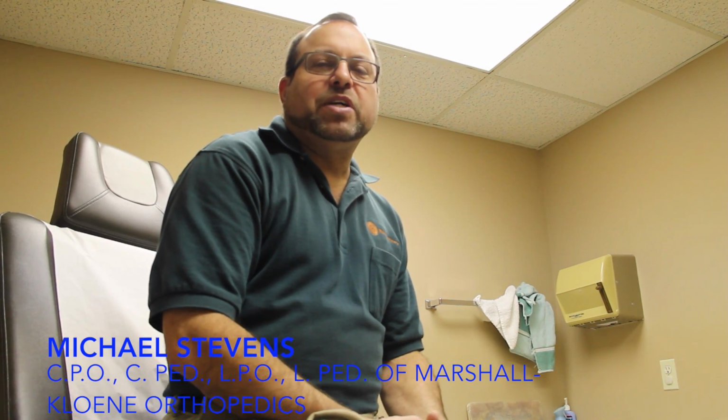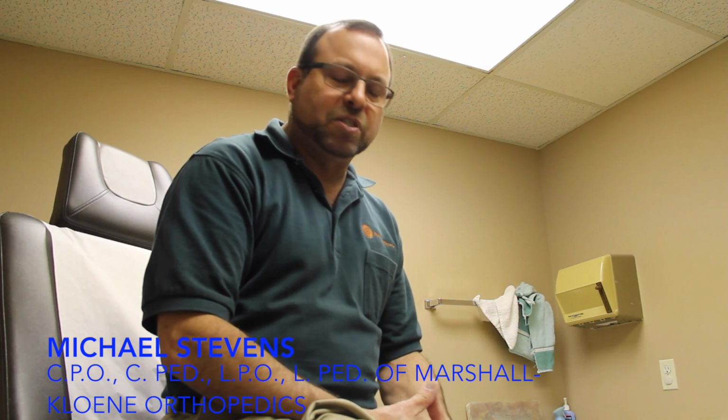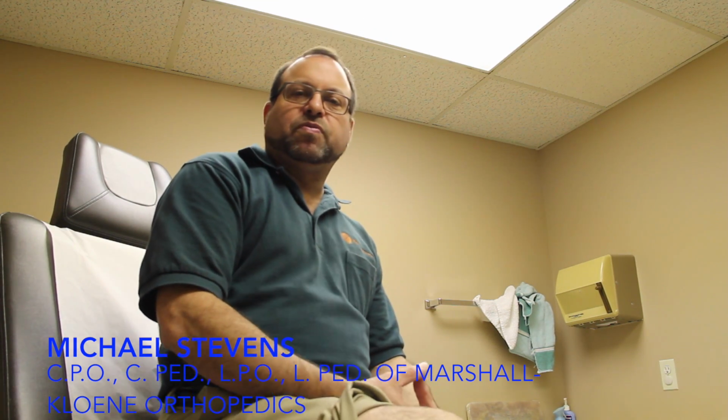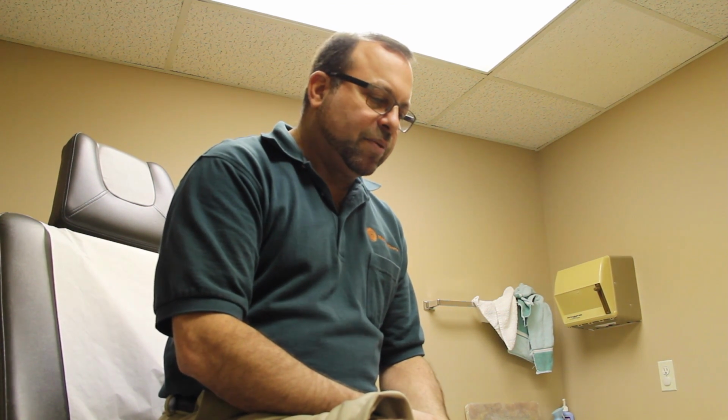Today we're going to show you the process of making a custom fabricated AFO. It's an ankle foot orthosis brace to help control different problems that we might have with the ankle and the foot. It could be post-tib tendon, it could be an arthritic foot, it could be post-surgery, post-fracture. We're just trying to immobilize it and get the swelling down and stabilize the ankle during gait.